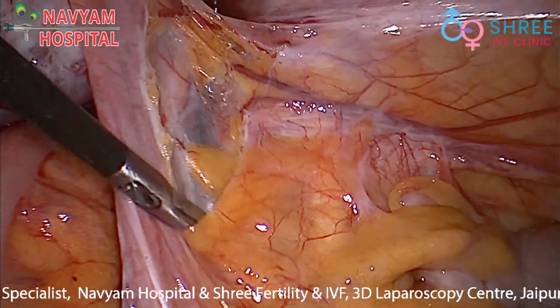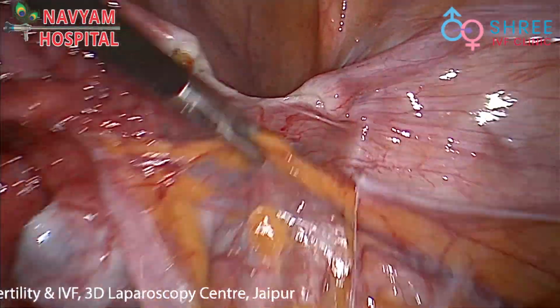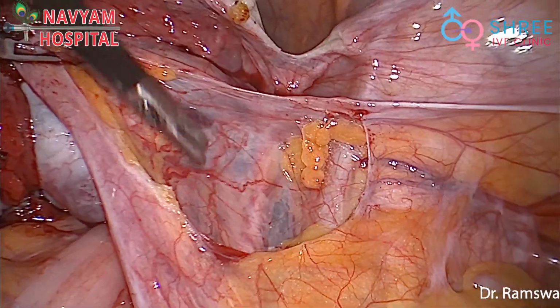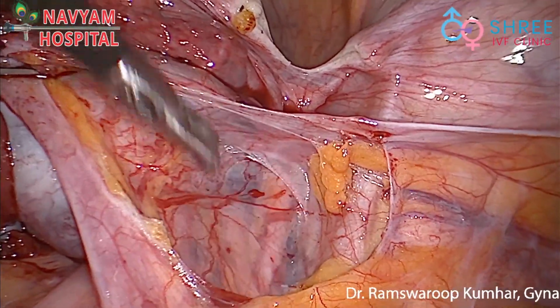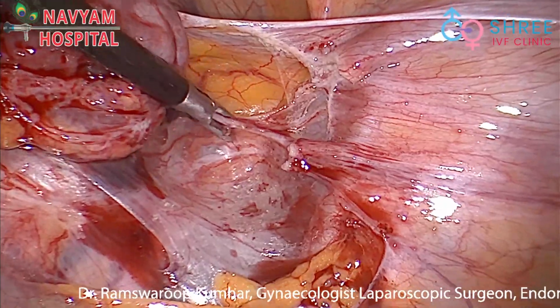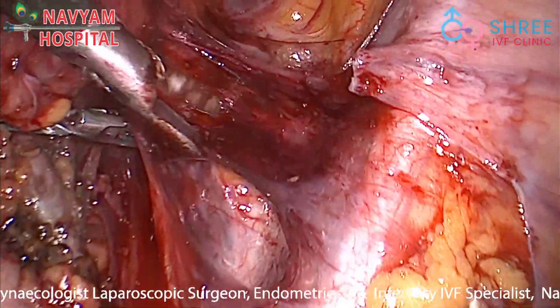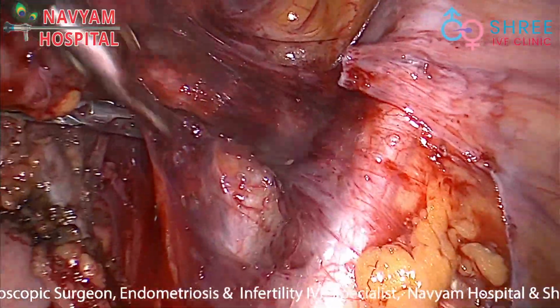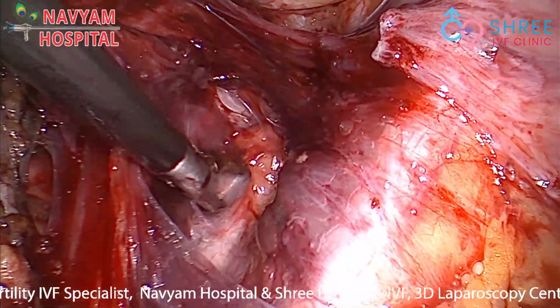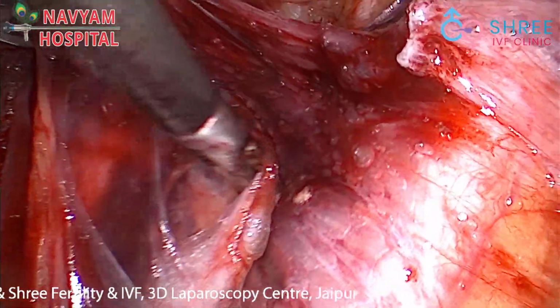So the uterine artery and the ureter were dissected in the lateral pararectal space. The ureter was dissected carefully deep down, and the internal iliac artery was identified and dissected well, and the uterine artery at the origin was well coagulated to reduce the blood supply to the uterus.